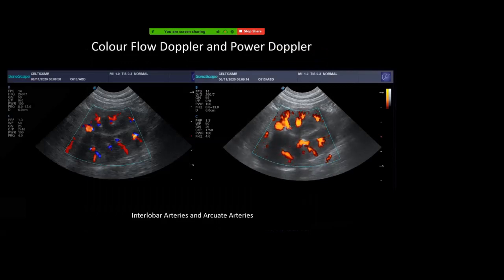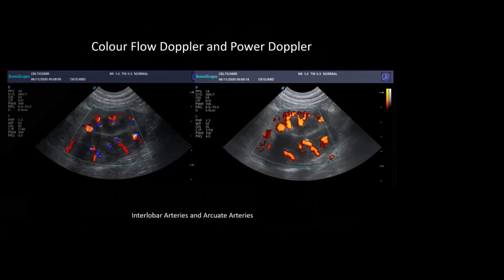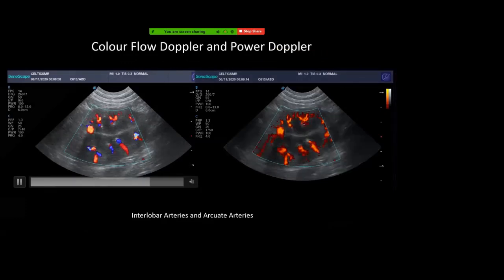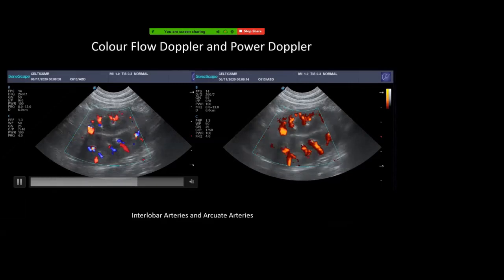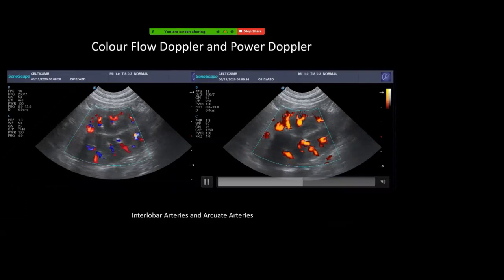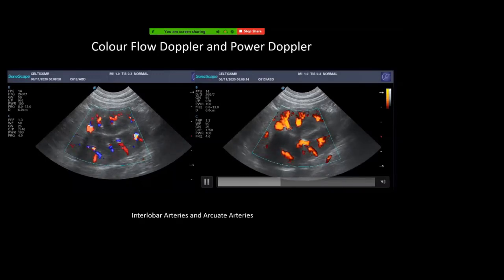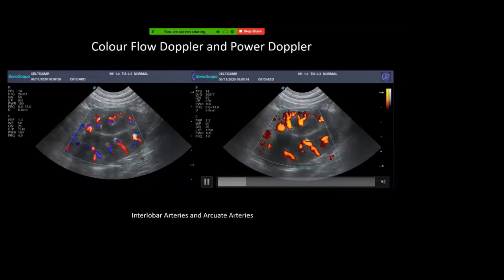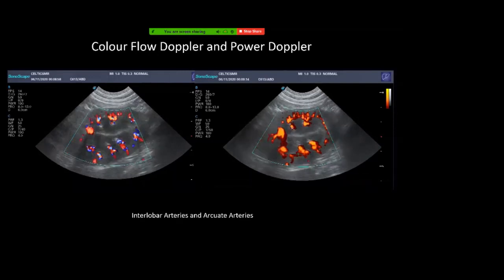We have two types of colour flow Doppler. Colour flow Doppler shows blood flow direction — blue is flow away from the probe, red is flow toward the probe. Power Doppler doesn't give directional information but is better at detecting very small low-velocity flow, which is useful when you have a mass and want to see if the vasculature has been disrupted by it.